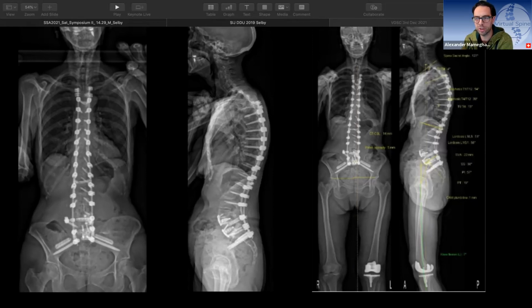And can you just explain the right L5 screw, how you connected this? Oh yeah, it's purely because of the line of her previous screws and the angle I needed to get a decent screw with a decent channel in L5. I could have resighted it with a straighter, shorter screw after I went for the rod, but when I've got some sort of secure fixation there in the front, I'm very happy to use little trans connectors.